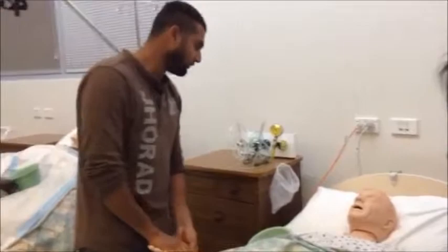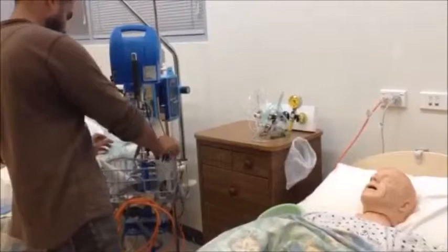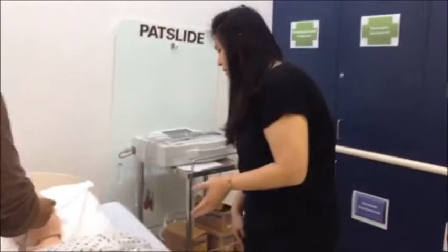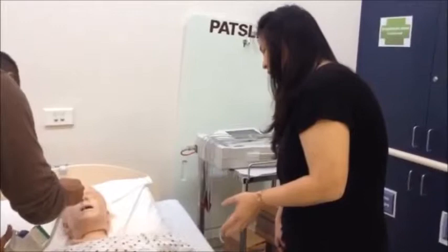I'll just check your observations and see how you're going with your assessment. Mr. Wellos, while Arif is doing that, I'm just trying to find out a little bit about your chest pain. How, what's the pain like? Sharp, burning, crushing? I'm just going to take the temperature. Sure, do that. Start with your tongue. Just going to put it there for a few more seconds.